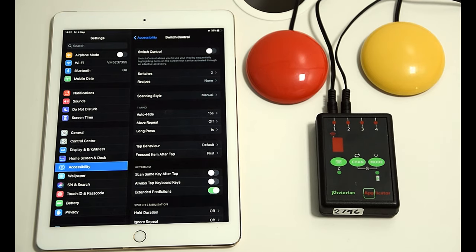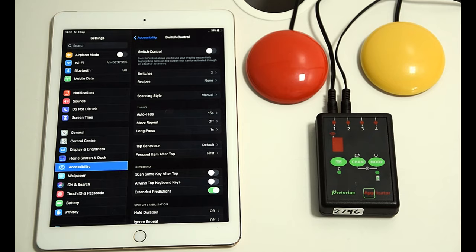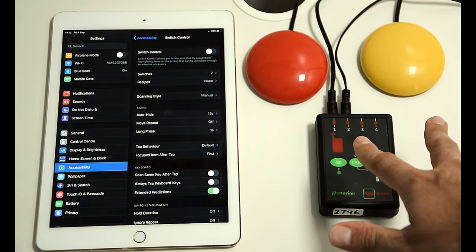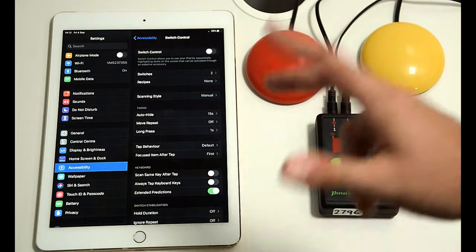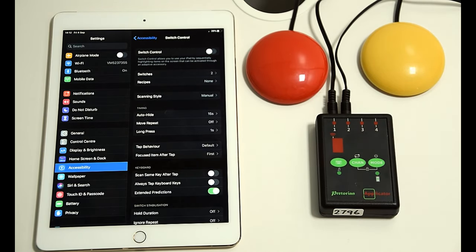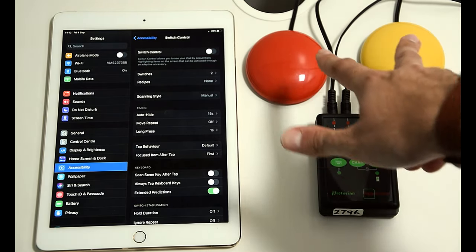So what I'm going to do is show you how to turn the pages, but I want to sort of start with a bit of an intro in that what you could do with your Applicator with the BM4 ports is you could have your switches set up as they normally are for scanning if the user can use all four switches.